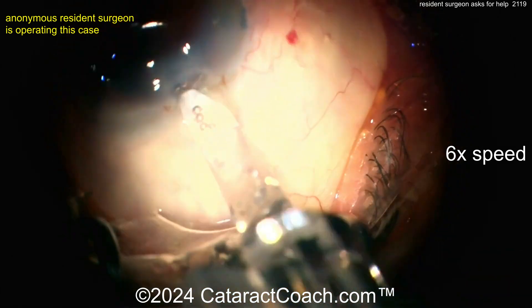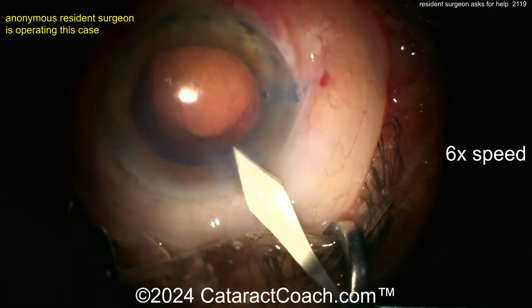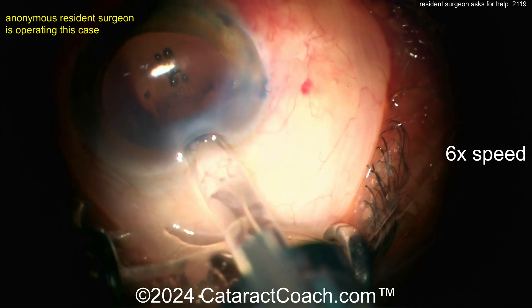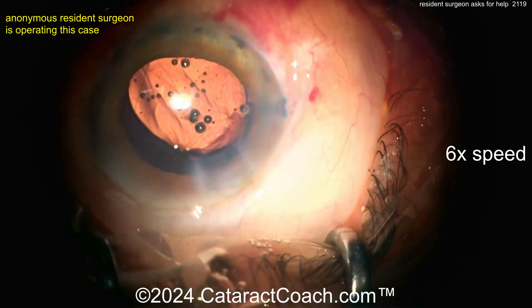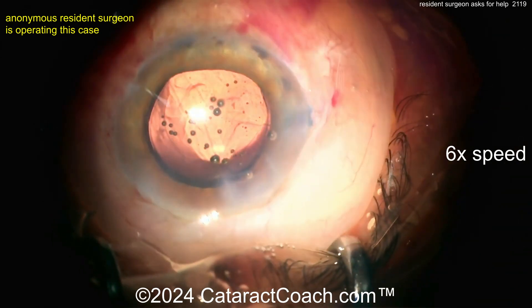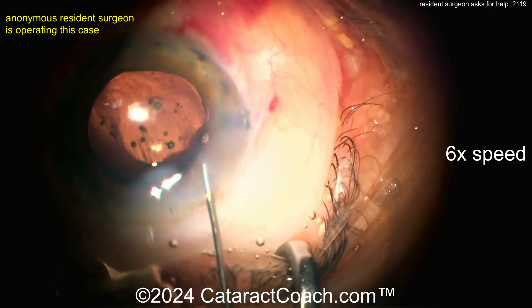Enlarging the incision — why not hold the eye to enlarge it? Why not use the second hand to help fixate the eye? You've got to take more pride in this. What's your signature here? Once all that corneal edema goes away, it's your incision and your rhexis — that's how I'm going to judge you. When I see this patient 10 years from now, I'll say let me see that incision, let me see that rhexis, who did your surgery?